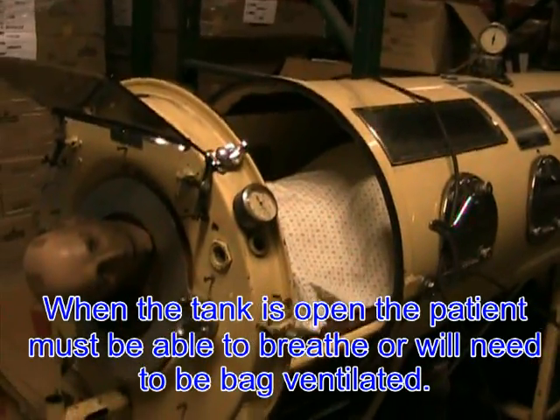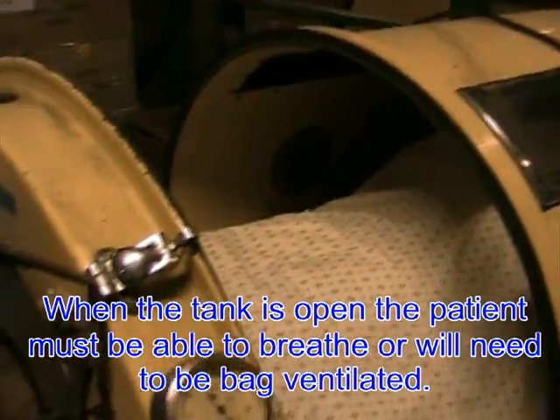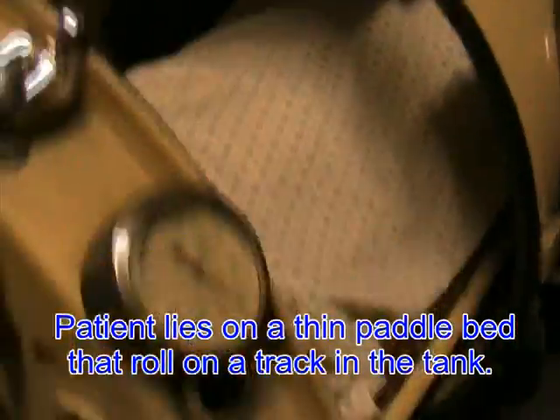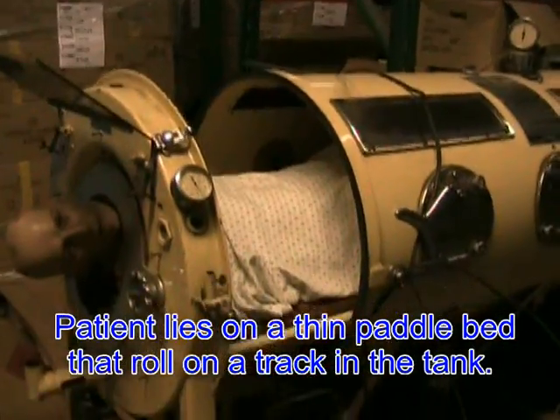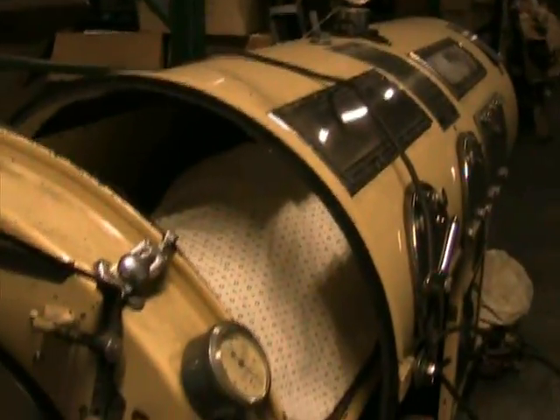Once the iron lung is opened up, the patient would not be breathing, so manual resuscitation would be necessary. But this allows access to the patient for procedures, for cleaning, for things that you cannot do through the small hand ports.